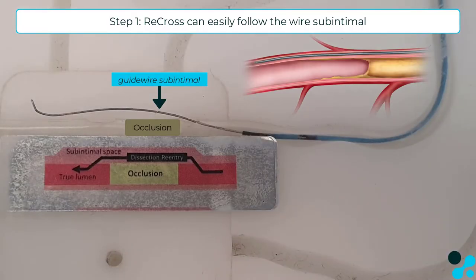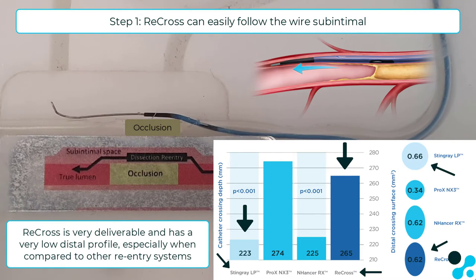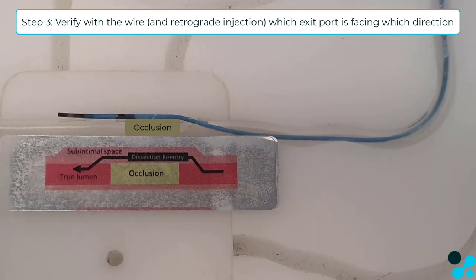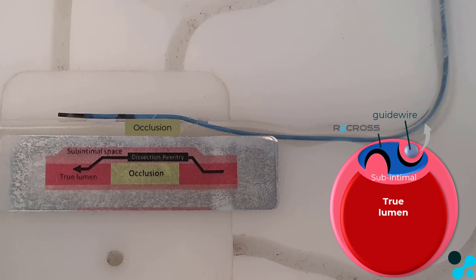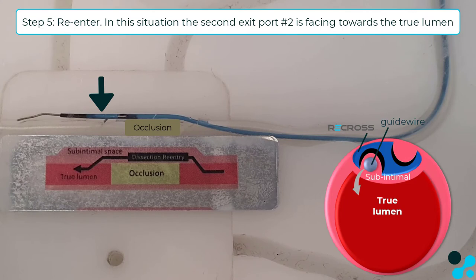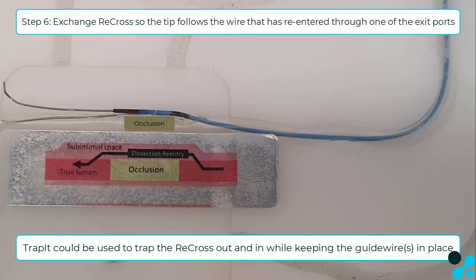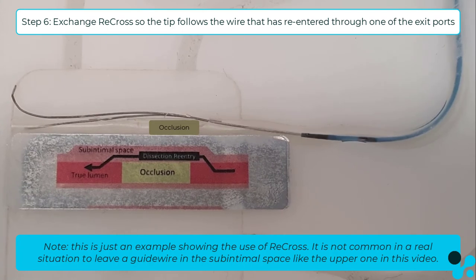When the guide wire has ended up sub-intimal, it is easy to follow this guide wire with the very deliverable Recross. One lumen has the guide wire inside and the other lumen is free to use — for example, to decompress and aspirate the sub-intimal hematoma. Verify in which direction the exit ports are located. In this case the proximal exit port is not facing the right direction, so the second guide wire can go through the blue stylet lumen, and as you can see, the second wire can re-enter through the middle distal exit port.